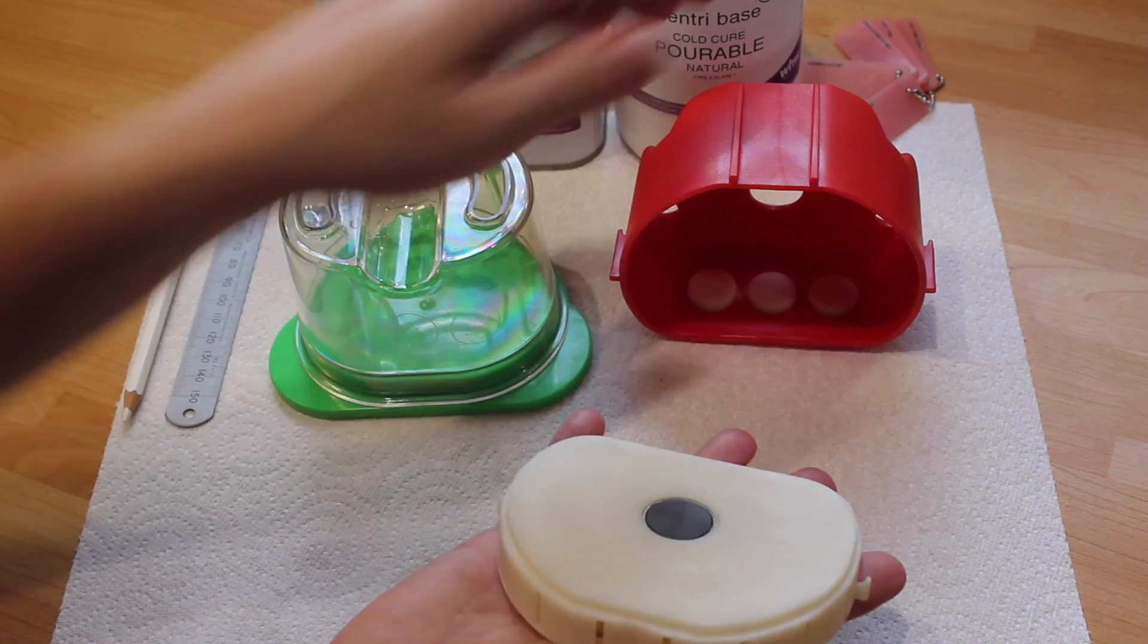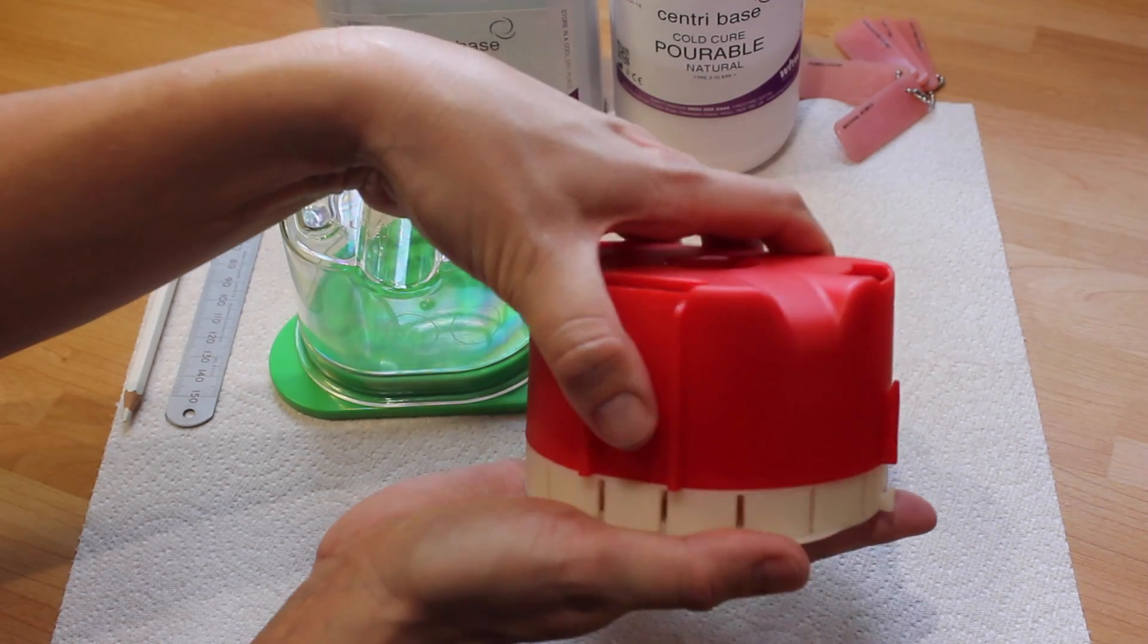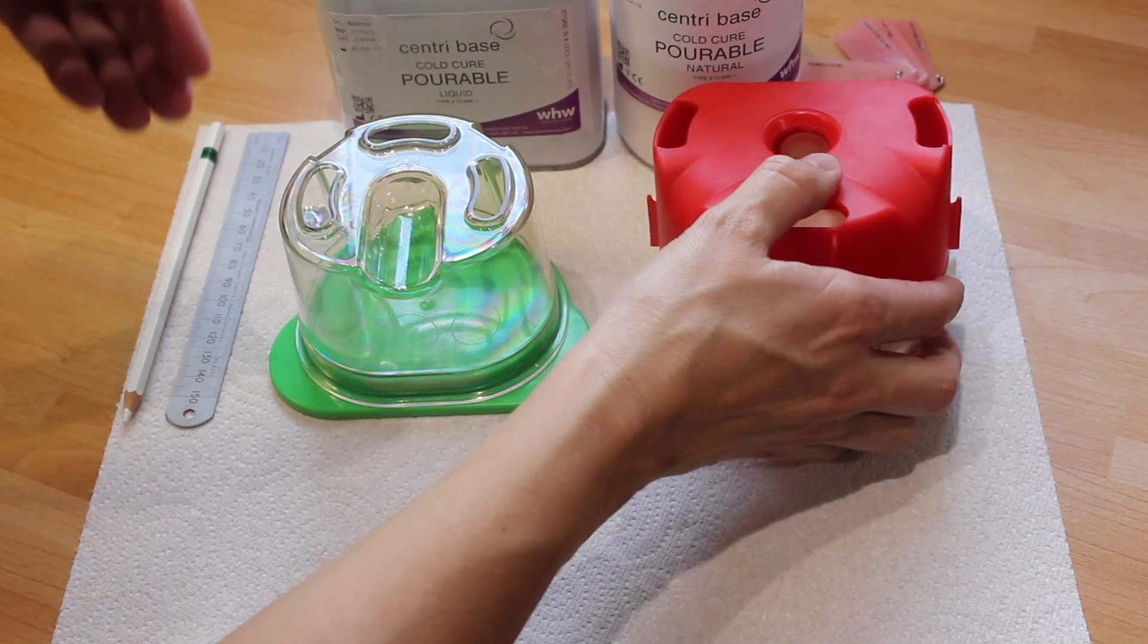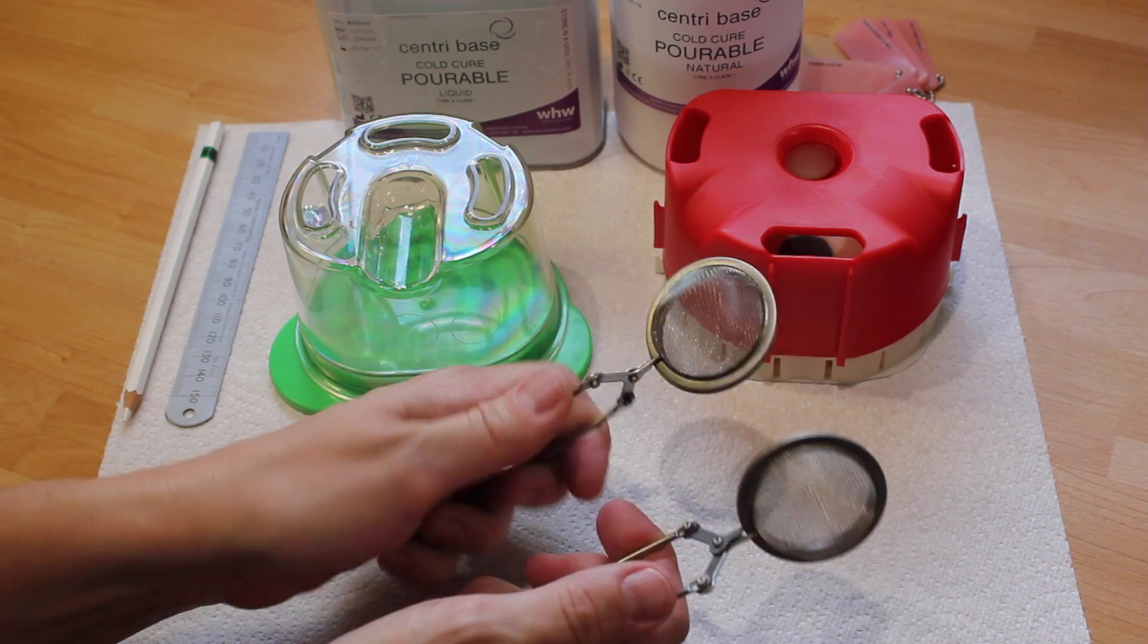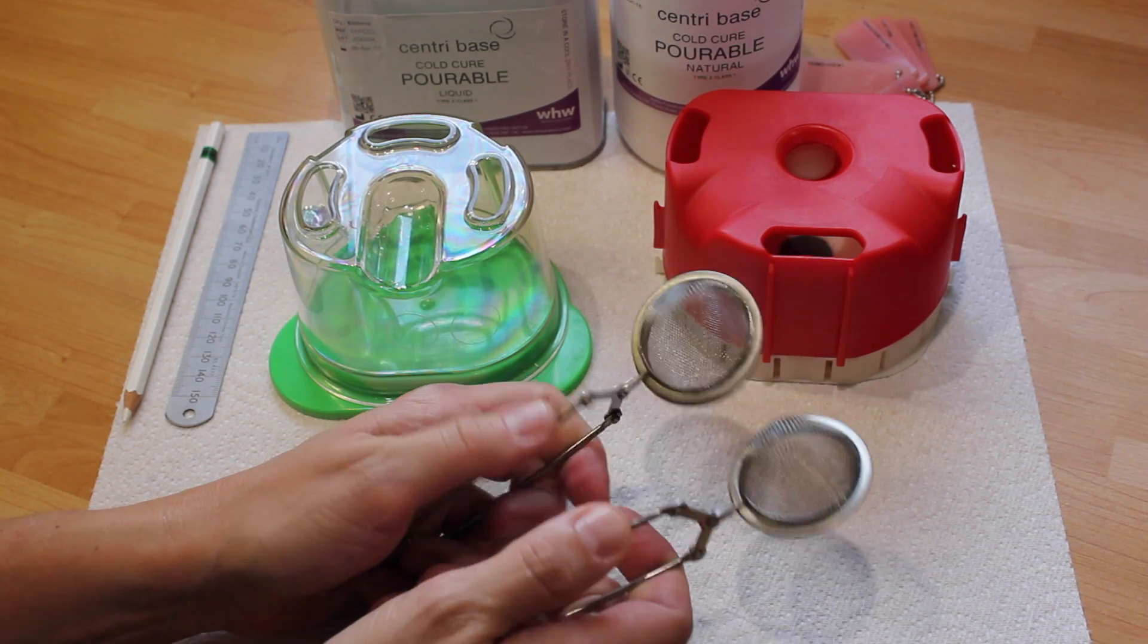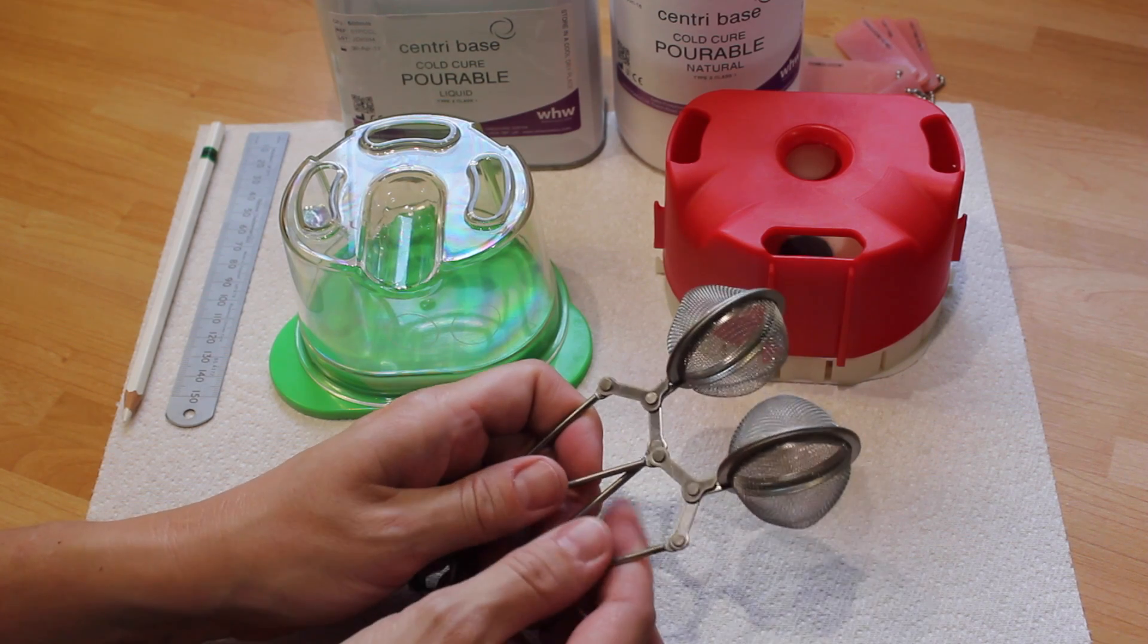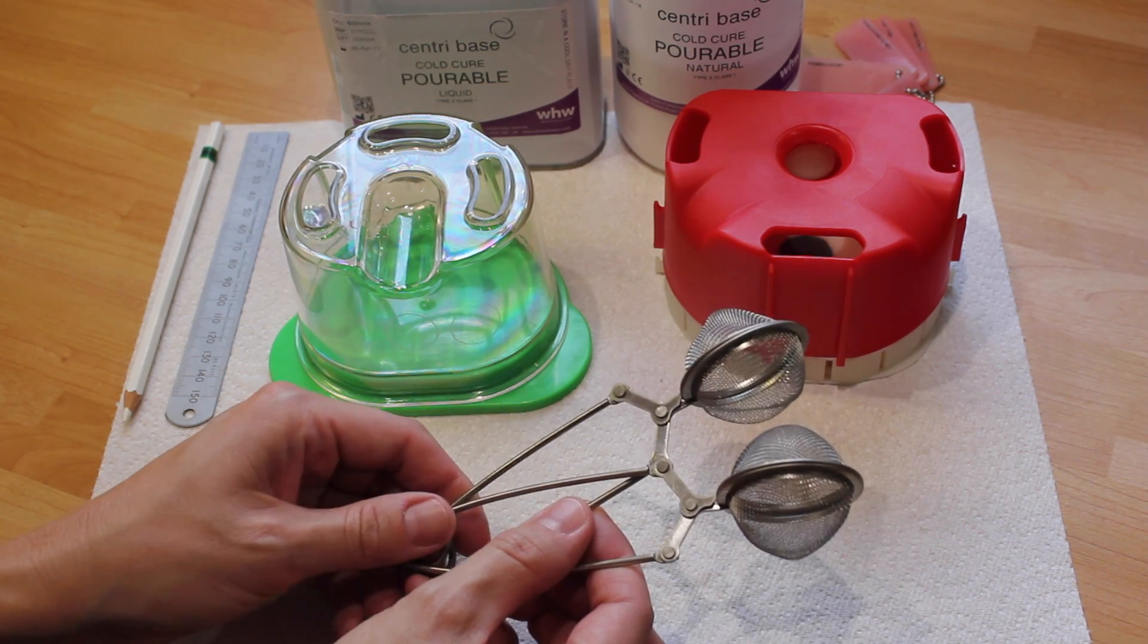This is something you would miss when you do flask customization. I find the use of small tea strainers like this very useful to prevent you mixing the teeth up before you put them back in the mold.